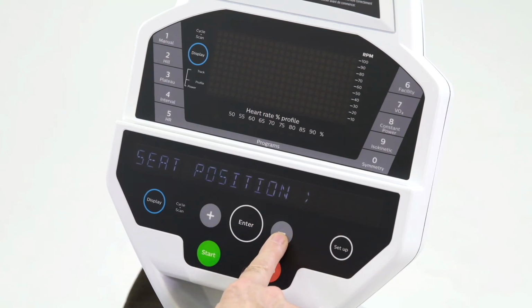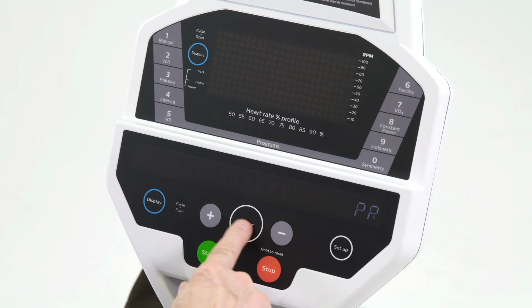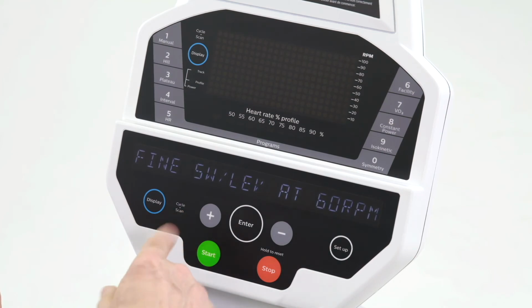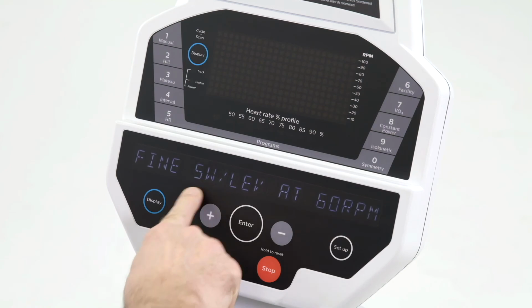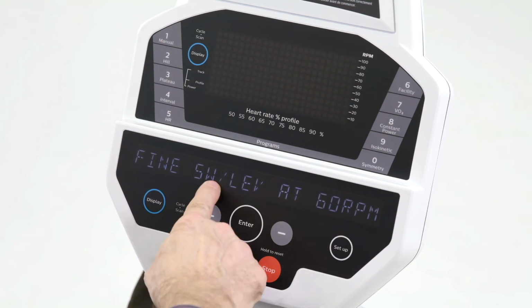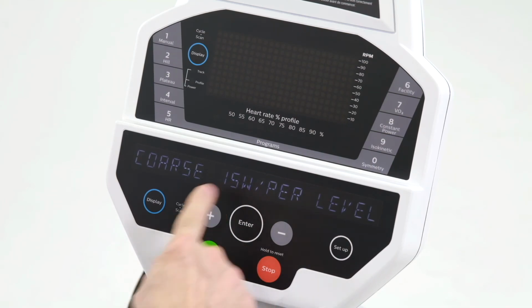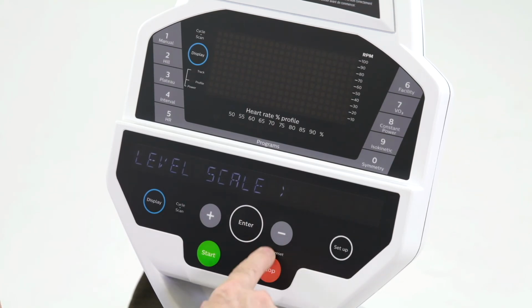The next function we have would be the level scale. What this does is allow you to customize the resistance levels when we are using the program. Right now the default is 5 watts. So each time I press and increase the resistance level, it'll increase at 5 watts each time. And I can select 10 watts per level or 15 watts per level. So we'll leave it at 5 watts per level.